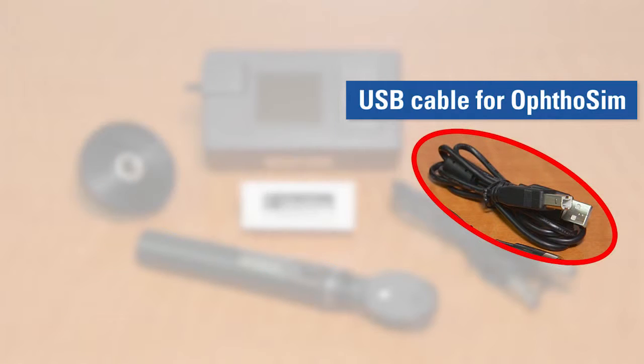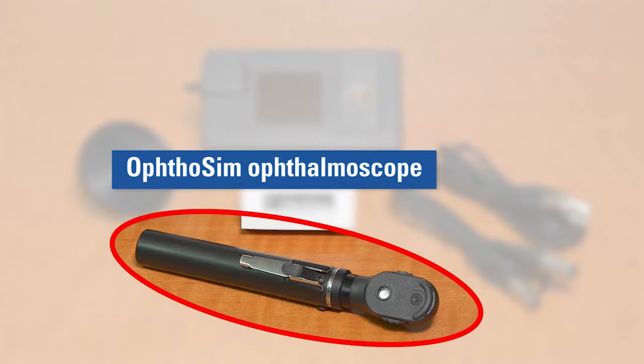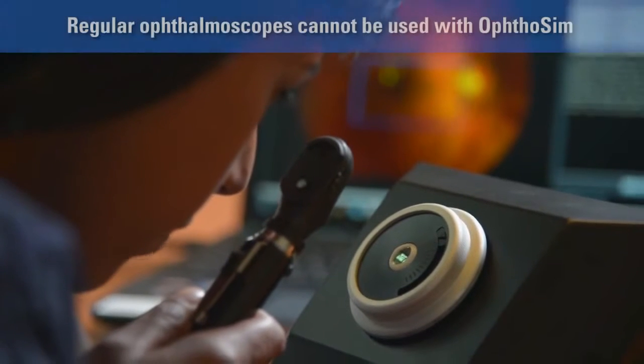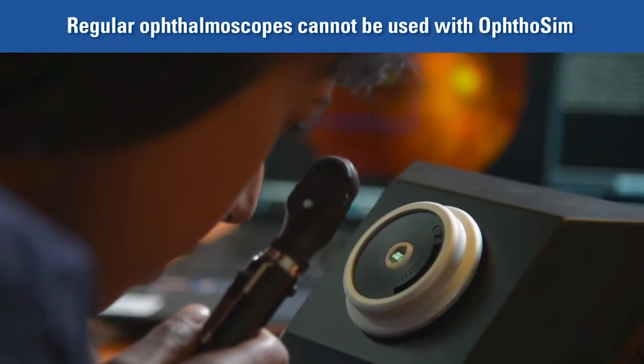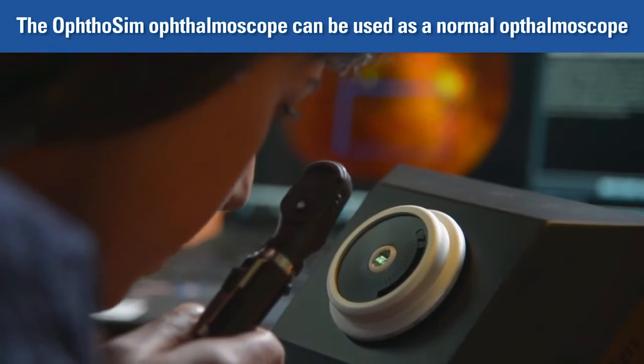4. USB Cable for Authosim — this USB cable is different from the USB cable that connects the Odosim Display Unit to the computer. 5. Authosim Ophthalmoscope — this ophthalmoscope has a built-in movement tracking mechanism. Please note that you cannot use any ophthalmoscope with Authosim, but the Authosim Ophthalmoscope can work like a regular ophthalmoscope.